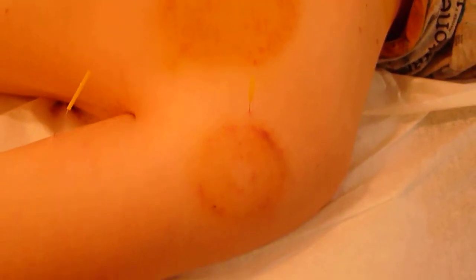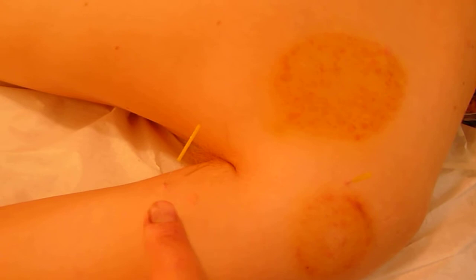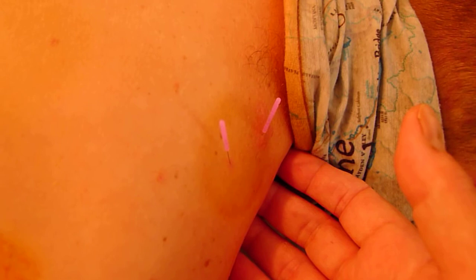The infraspinatus muscle — this happens to correspond to an acupuncture point as well — and it's a trigger point in the infraspinatus. You'll notice I did cupping last week, and the reason those marks are so strong a week later is because his muscles were so tight. I've also found clinically over the years that when someone has a shoulder problem, it's often very helpful to release the triceps, and that's very overlooked — I discovered that years ago when treating someone who cut hair for a living.